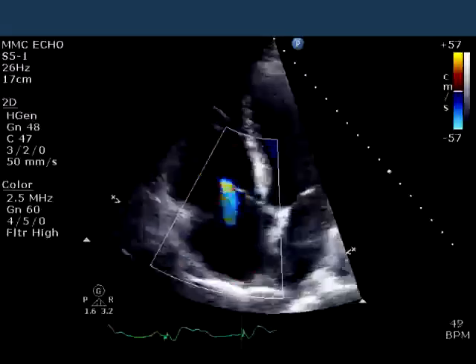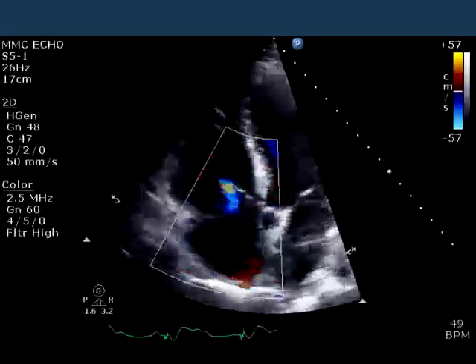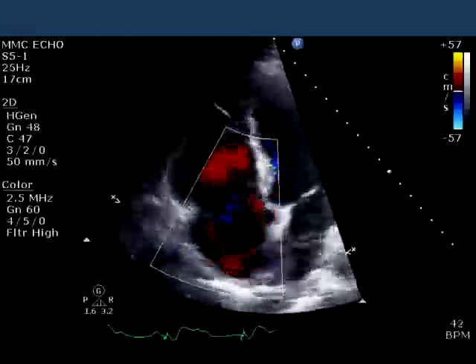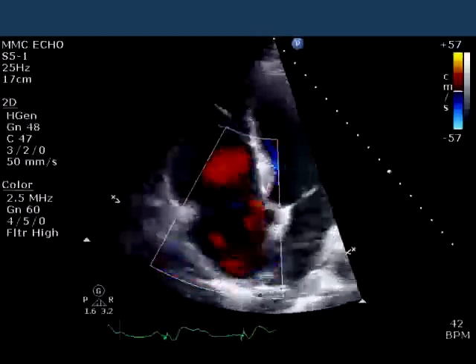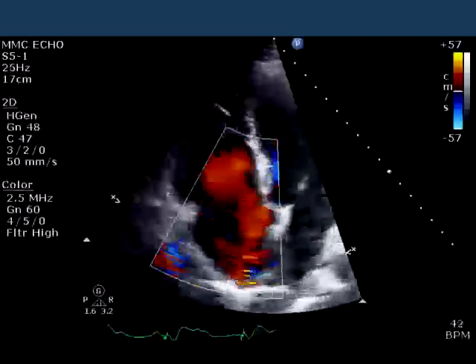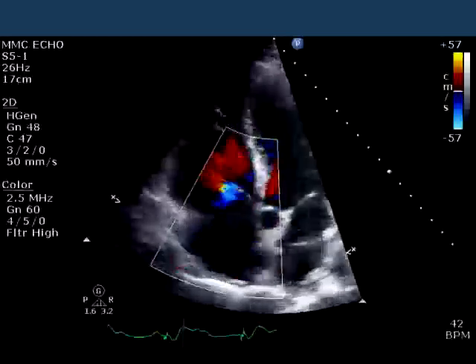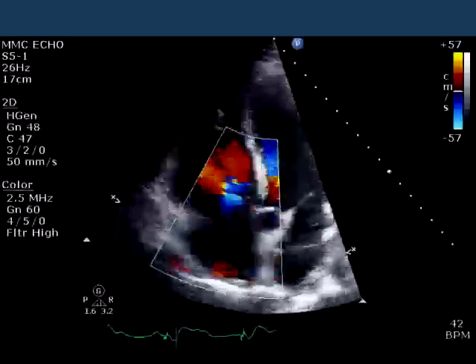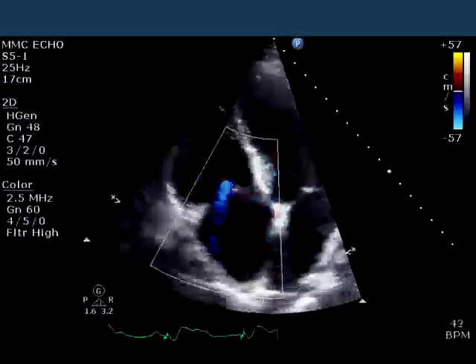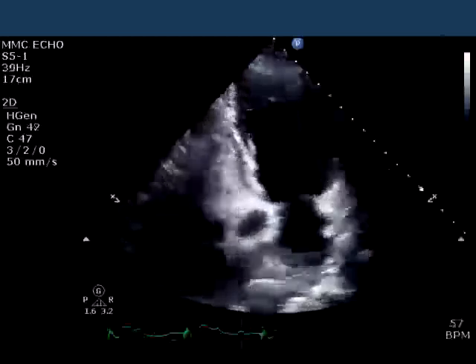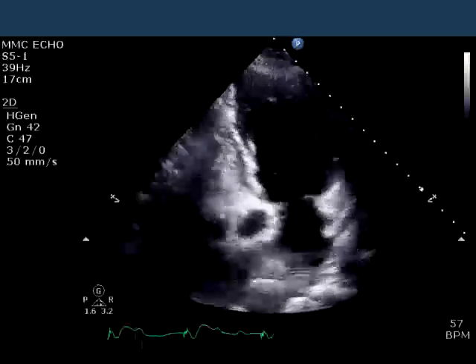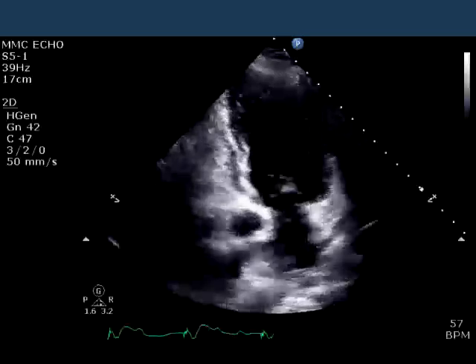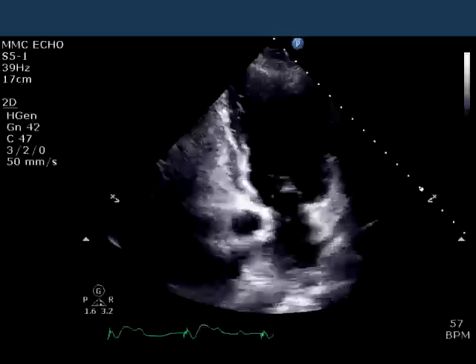Focusing on the tricuspid valve with color Doppler, you can see that there are color signals of tricuspid regurgitation present both in systole — during which the TR jet looks more turbulent with a mosaic of colors — and in diastole, when the signal looks more like a soft blue representing a lower velocity. This is now a two-chamber view, and you can see that the anterior wall is thickening normally and the inferior wall is akinetic.